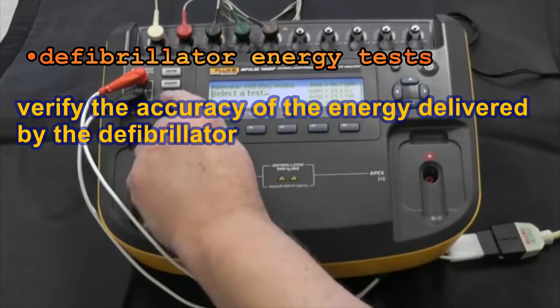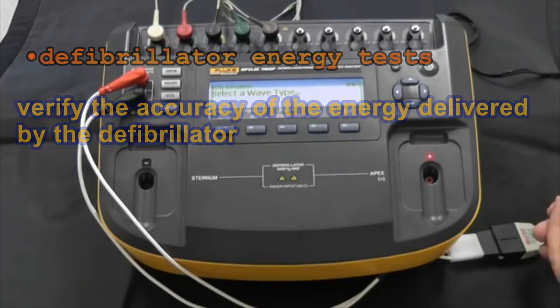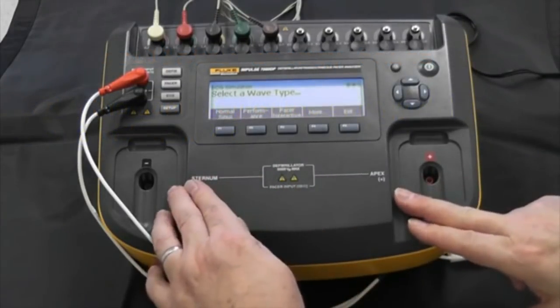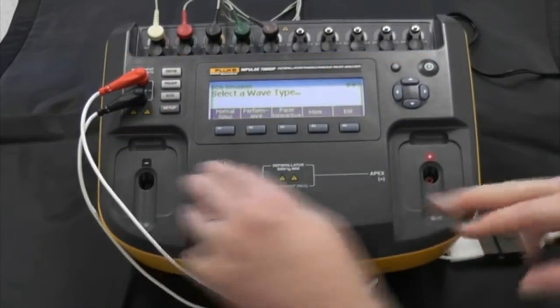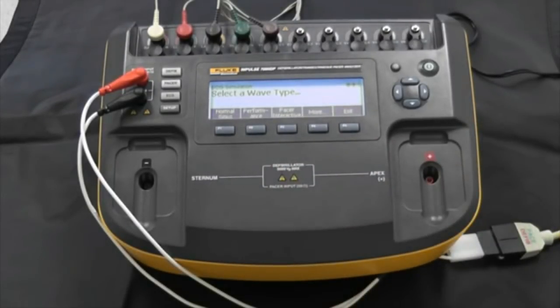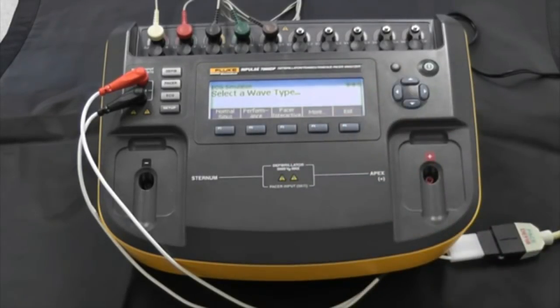For ECG, these are simulated waveforms that are delivered through the lead wires and also through the pads or paddles connections. We have a variety of different categories of wave shapes that can be displayed and sent to the patient monitor part of the defibrillator. This is important when you're going to do AED testing — you can select a whole range of different arrhythmia waveforms.